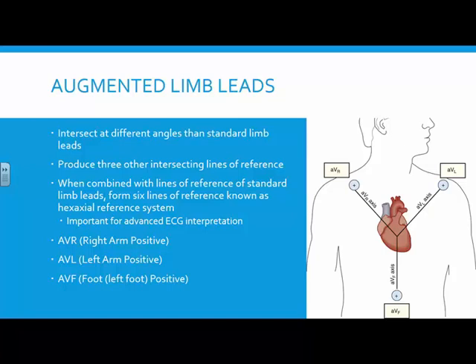Everybody said they've seen a 12 lead. The first 3 leads is leads 1, 2, 3. The second 3 leads is leads AVR, AVL, and AVF. Alright? Remember how I said that they are unipolar, meaning that they've got one distinct pole, and that's the positive. But we have to look from negative to positive. Well, they form a collective negative. The monitor does that for you. Alright? So AVR, what are we looking at?